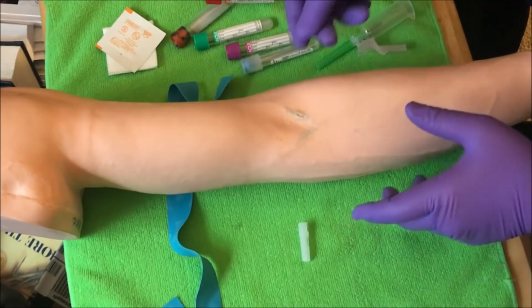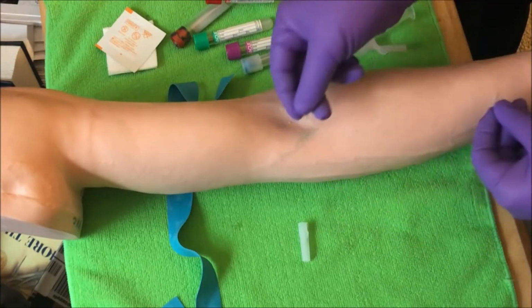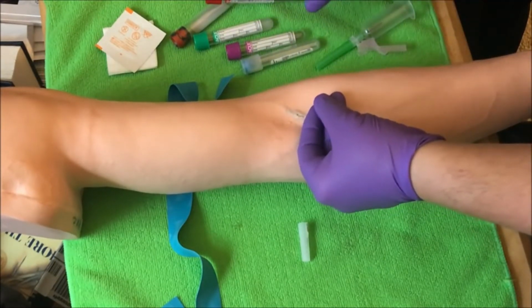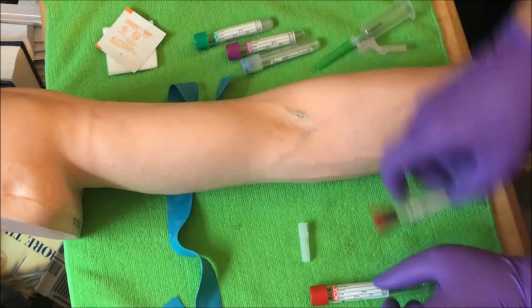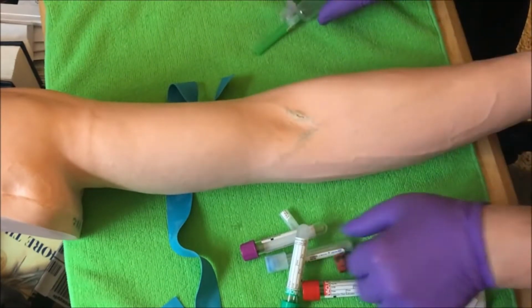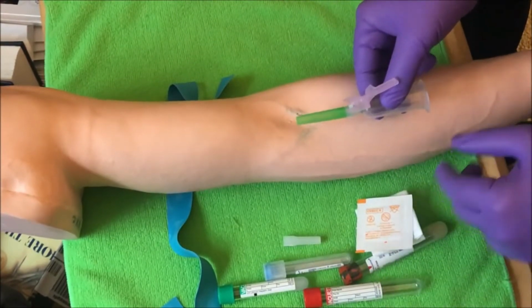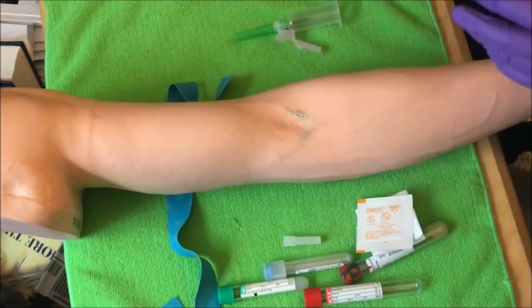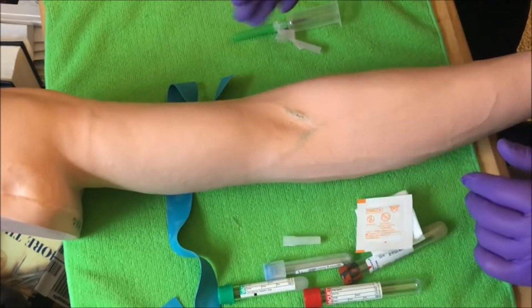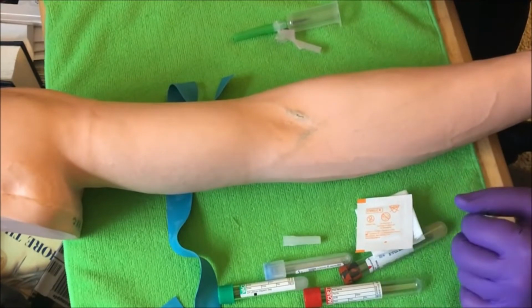The reason being is I don't want to be drawing here and having to reach over. So if I'm left-handed, then here I can take my equipment. In this case, I'm right-handed. I bring my stuff over here, just like this. And now I'm ready to go. This is so that when I'm in, I can easily get my equipment. I don't have to reach over. So depending on whether you're right-handed or left-handed, you want to make sure your equipment is on the side that you're going to be reaching for to grab your tubes, not on the side that you have the needle. I don't want to be reaching over because that can cause the needle to move and discomfort for the patient. Okay, so everything here is ready to go.